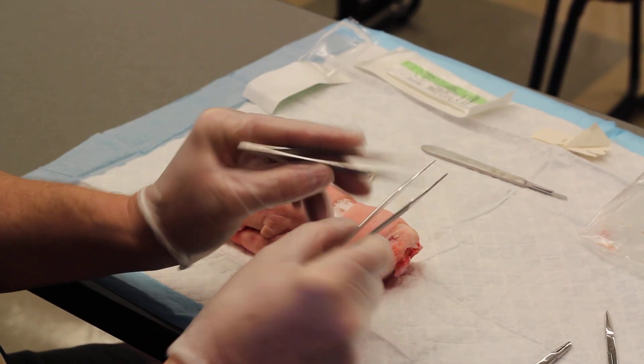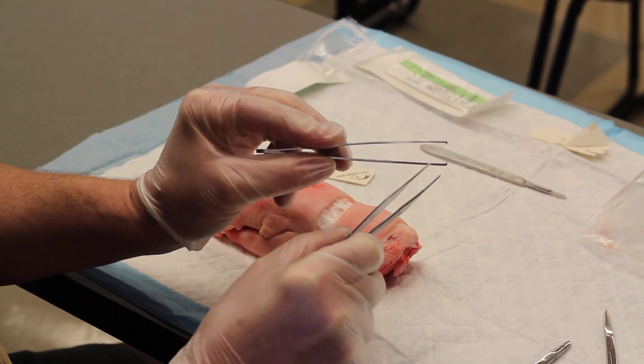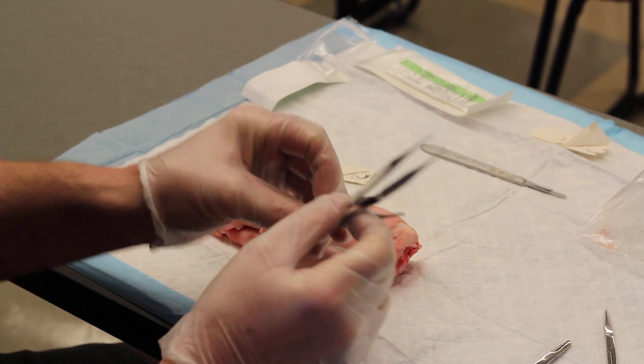So those are the Adson forceps — with teeth and without teeth. Disposable suture trays mostly come with the Adson forceps with teeth.